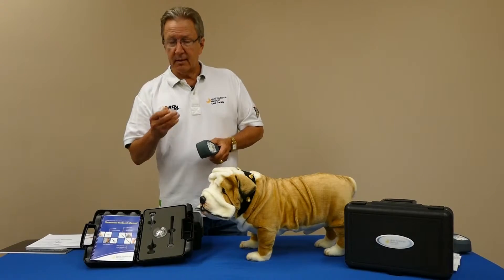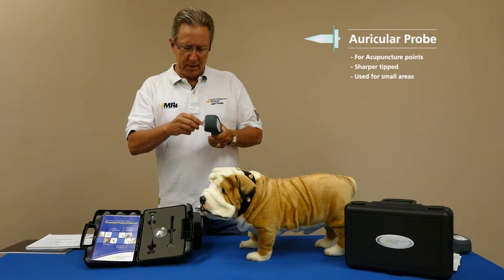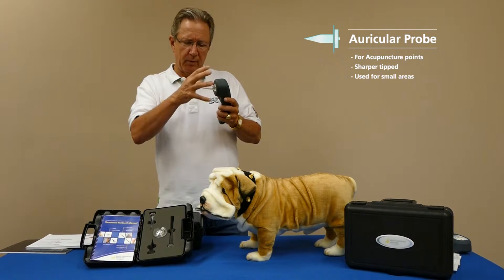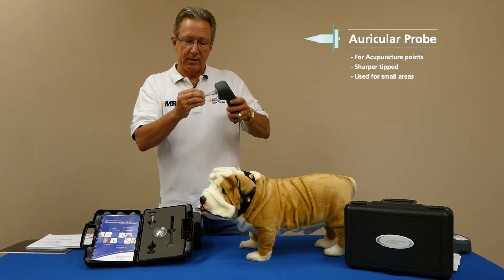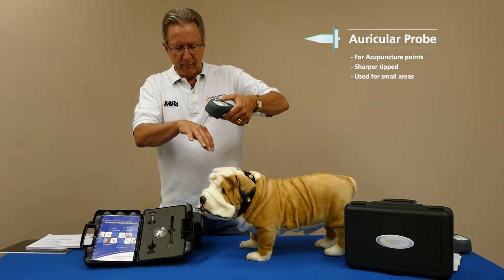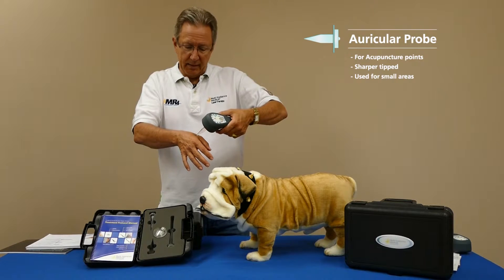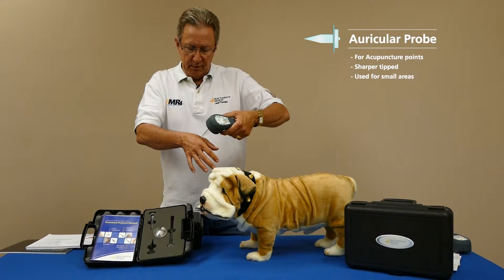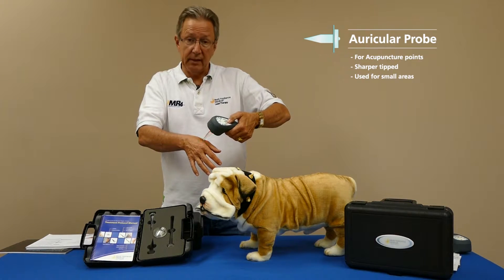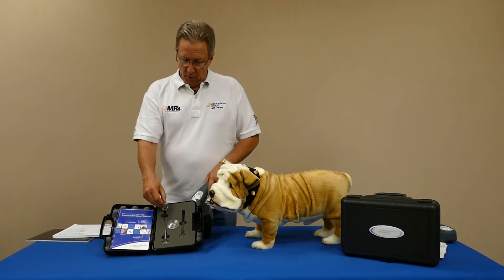The next is our acupuncture probe, also referred to as the auricular probe — it threads on just the same way. Some acupuncturists like to use this sharper tip; it acts as a wave guide, taking all that energy to one specific point. You're just placing it without much pressure at all on that acupuncture point, and typically about 15 seconds is all it requires to give you that nice, profound response. That's the auricular probe for acupuncture.